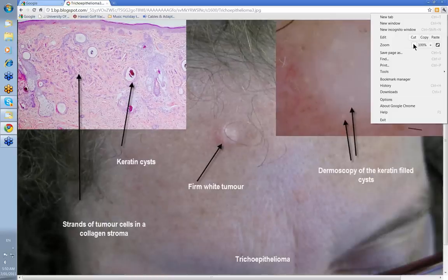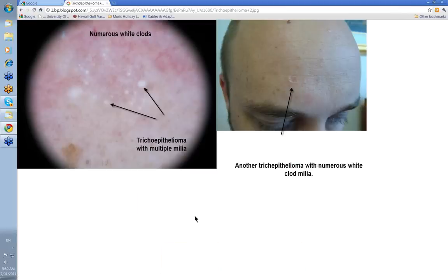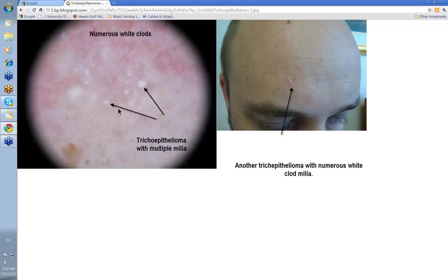Let's move on to the next slide — this is basically just another trichoepithelioma. Clinically, this is the lesion here. Not quite as white as the last one, but you can see the little white areas just around the outside. When you put the dermatoscope on it, you'll see these various milia-type cysts opening up — keratin retention cysts within the dermis opening up with your dermatoscope.